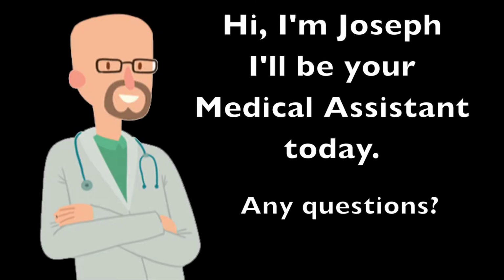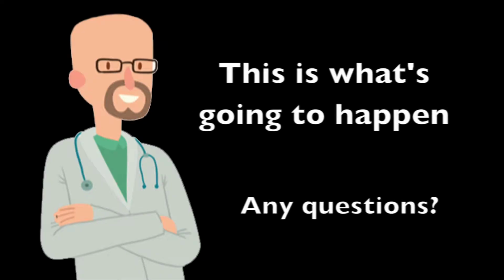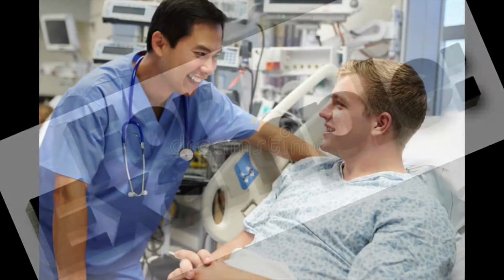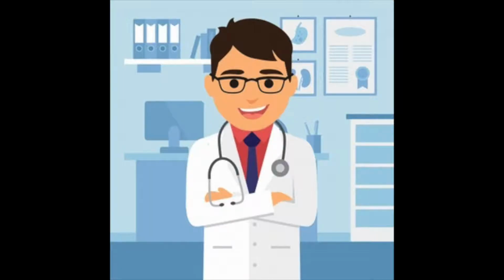The student will introduce him or herself and his or her role as a medical assistant. The student should also identify and introduce the clinical supervisor present for this invasive procedure. The student will explain the procedure to the patient and the steps involved. As part of the initial introduction, the student should confirm the patient or model's understanding of the procedure and elicit their verbal consent to proceed on video. For example, "Hello, my name is Joseph. I'm one of the medical assistants here in the clinic today. Can you tell me your name and date of birth?" "Thank you. Here with me today is my clinical supervisor. His name is Dr. Smith.